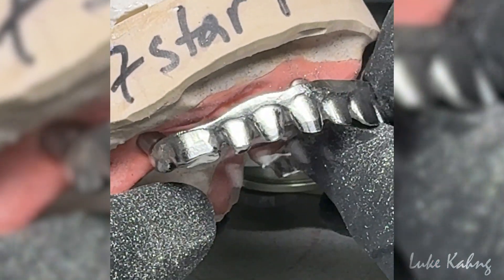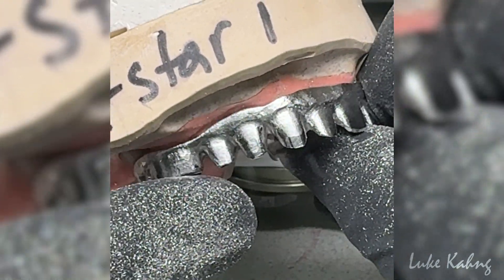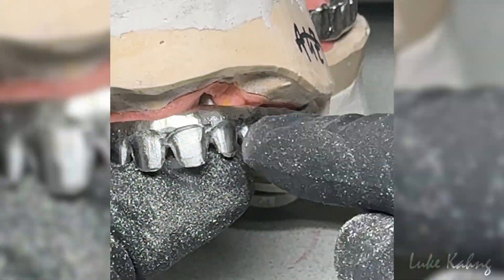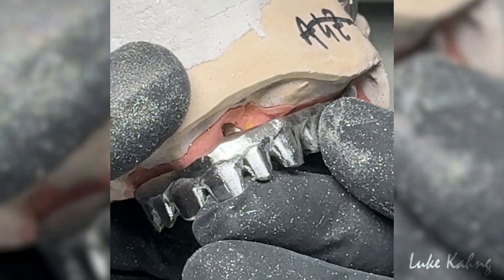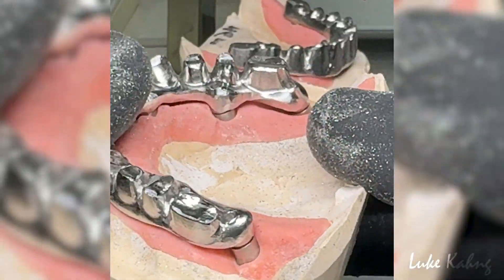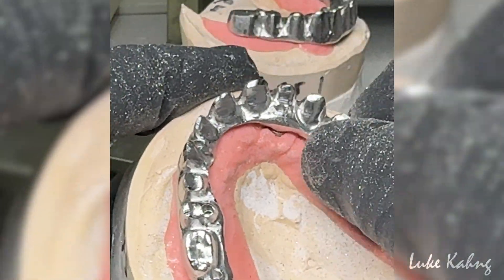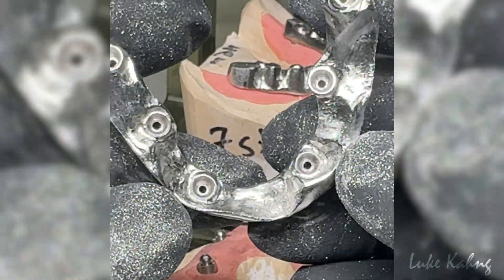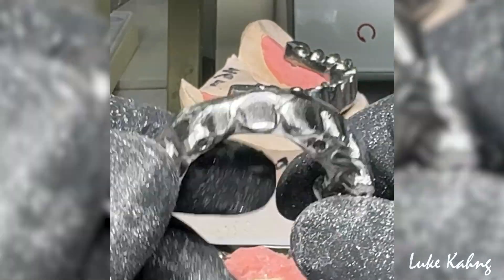So I'm trying to cover the gap — I'll go just slightly, not a lot here. I'll be okay in this area. And then I don't need — oh yeah, this is better, that's good. This is guidance. So unfortunately I have to cover here. I could bring down a little bit, but I have to cover one side.